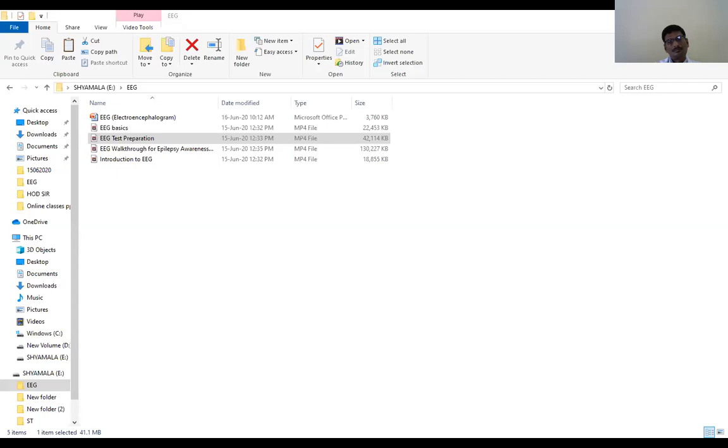I want to familiarize you also with 2 electrode application techniques that we may be using. The first is the paste method. The technologist will first rub a small amount of skin preparation gel on the measured spot using a Q-tip. Next, we will fill the cup of the electrode with a paste substance that has the consistency of toothpaste, and then adhere it to the scalp with a cotton ball. This method can only be used on patients that are able to hold still and only for the shorter exam. The electrodes are more easily displaced with this method if head movement occurs.